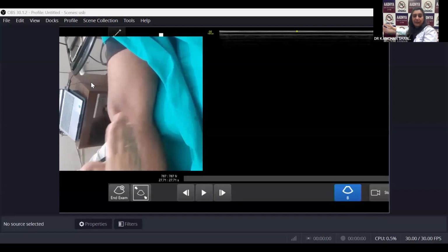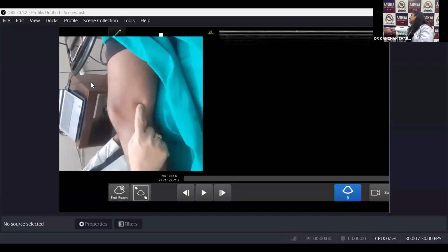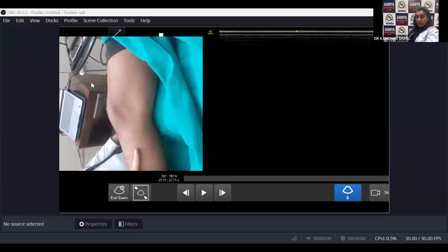Now about the medial collateral ligament. So a ligament is something which will be connecting two bones, right? So we have one ligament on the medial side like this. So this ligament, do remember, if this is your femur condyle, somewhere here will be the tubercle, the adductor tubercle. So this goes from here. It is going to go like this. So how are you supposed to move your probe?